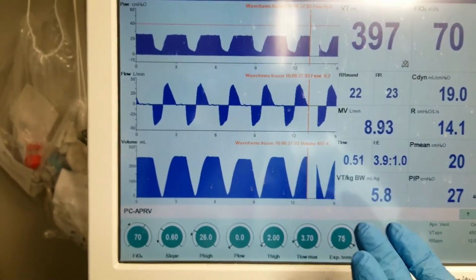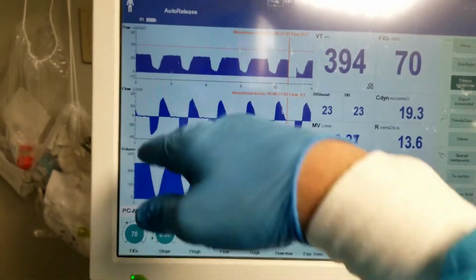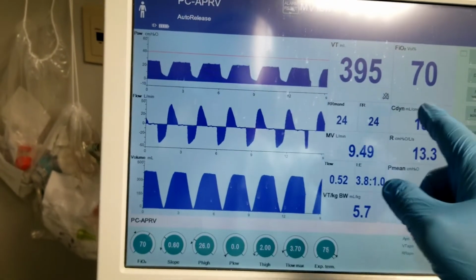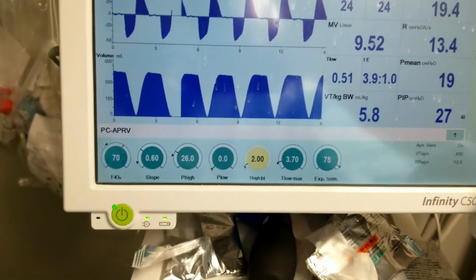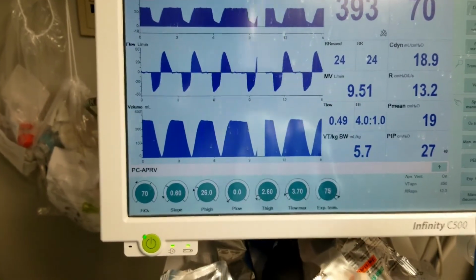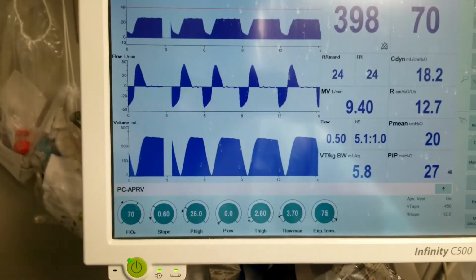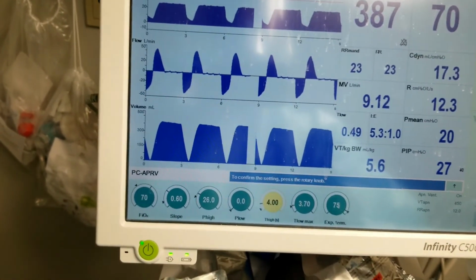So I find when we do ACPC, but we use PC APRV in a TCAV method, start with ACPC, create the mandatory releases, which are the breaths, they're acidotic, bulk ventilate. Let's say here, I have a good blood gas. Okay, great. Why don't I stretch it a little bit more? So now it's ACPC looking, but we're starting to have a long stretch. I do another blood gas. Awesome. It's good. Stretch it down. And before you know it, you have a stretched out patient.